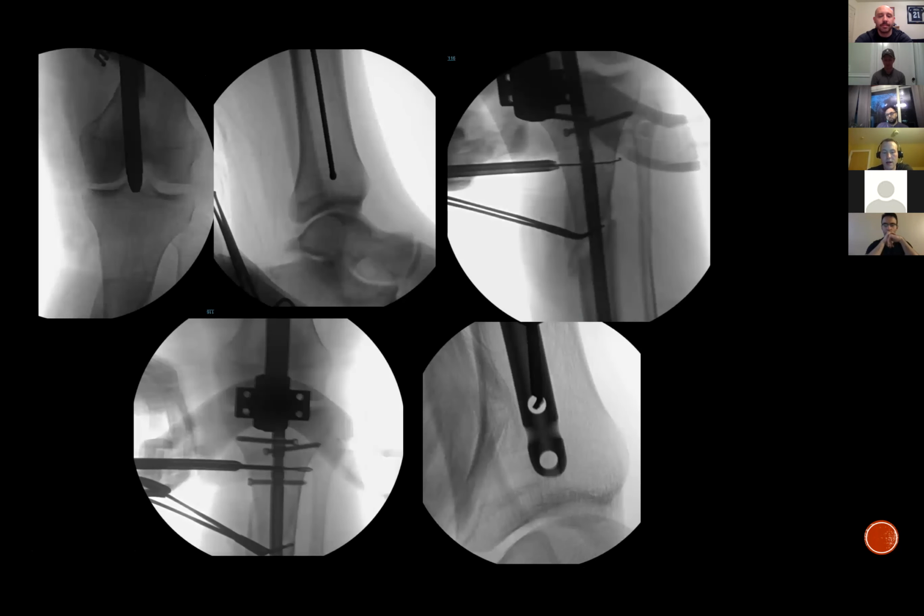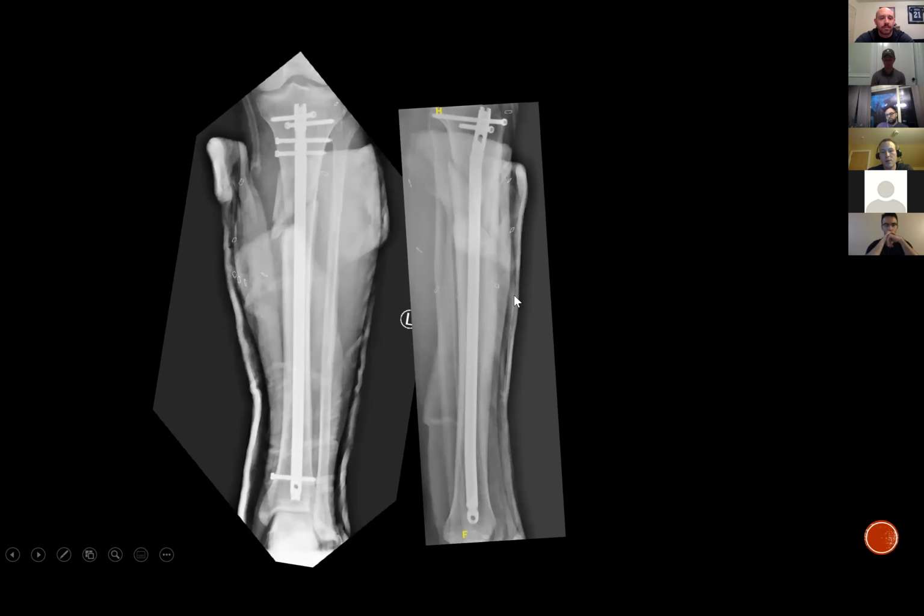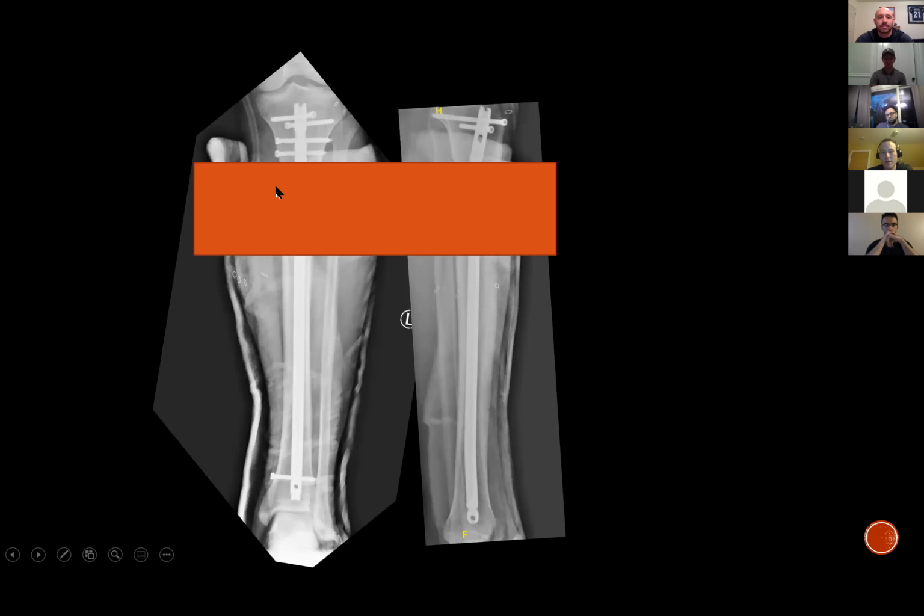So in order to do that and impart more stability, we put multiple angles, multiple screws in. Here's our perfect circle for the distal part. And here's the completion. Again, this looks like crap, but who cares? The joint surface, relative to the joint surface, is correct. And what happens in between doesn't matter. It'll heal.